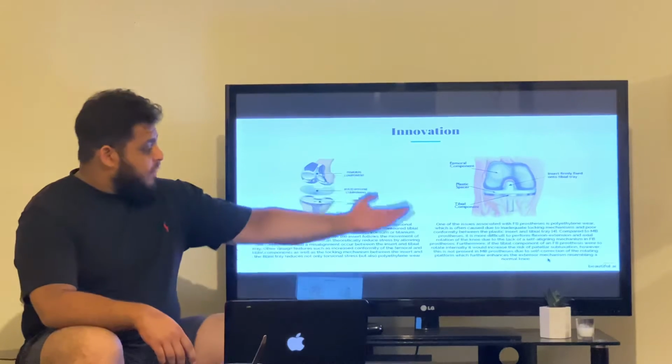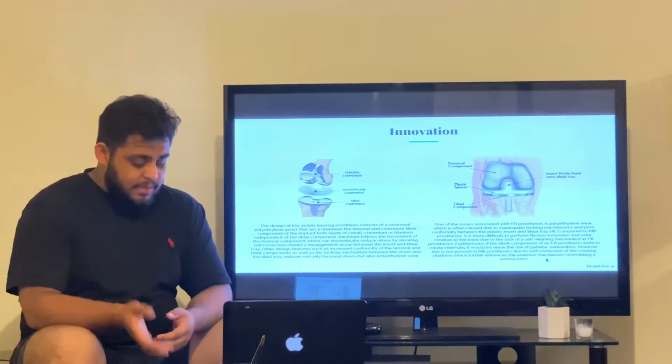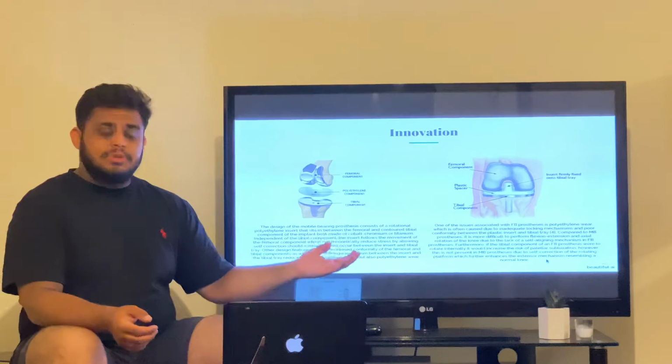Now, the fixed bearing prosthesis has a lot of issues, one of them being the polyethylene wear, which comes from poor locking mechanisms.